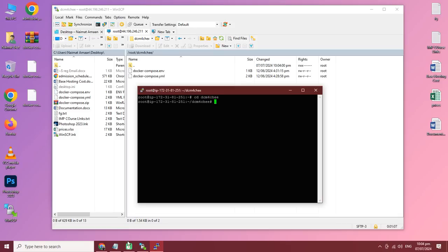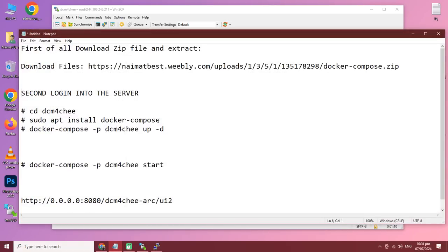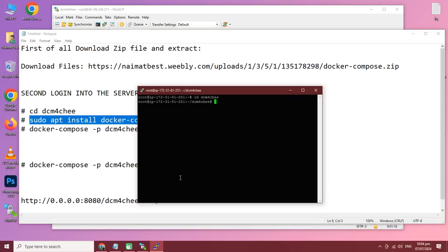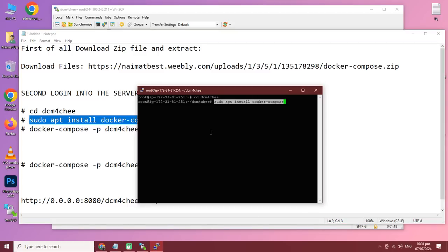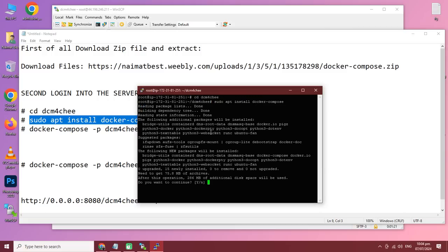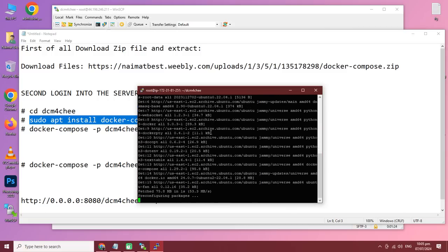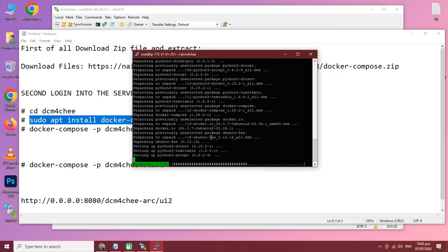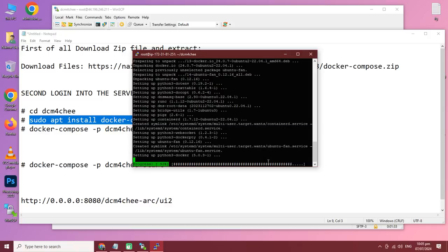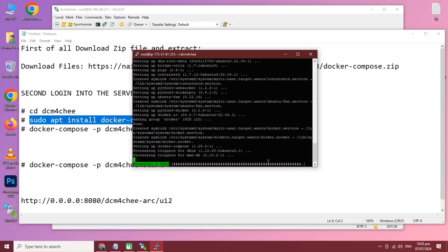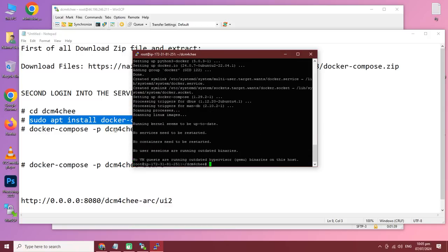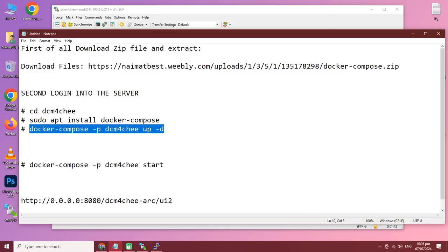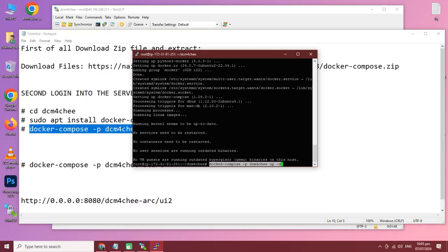I have already connected. Run 'cd DCM4CHEE' to go to the directory. After that, we need to install Docker Compose to install DCM4CHEE. Run the install command — here we go.